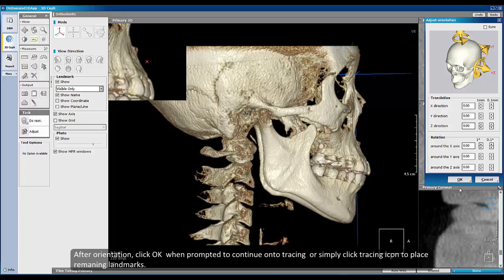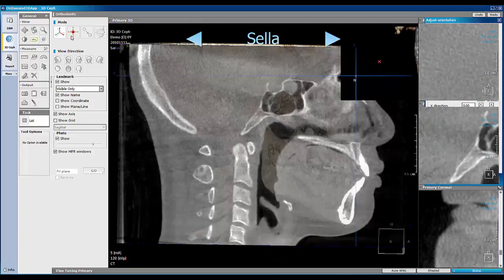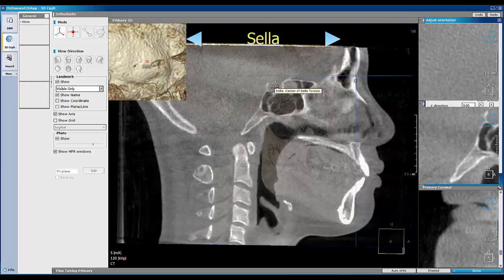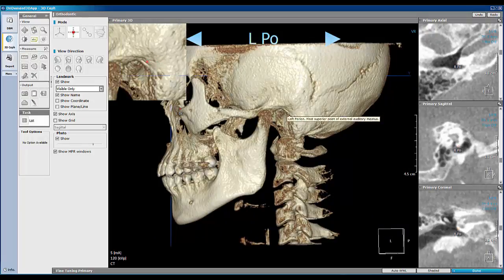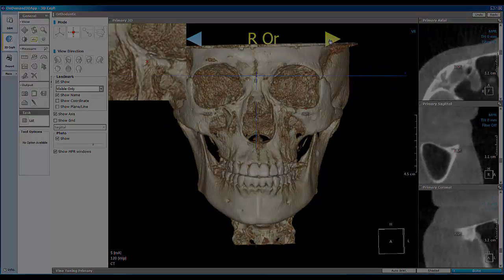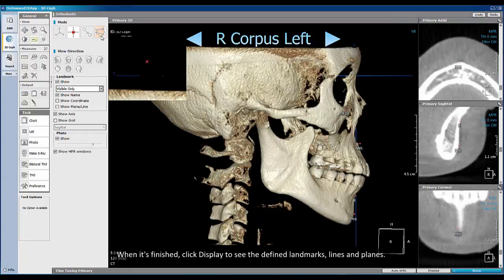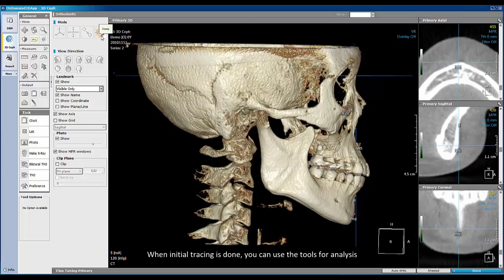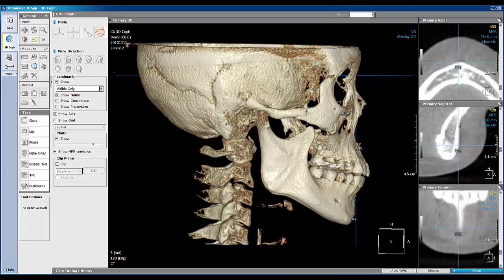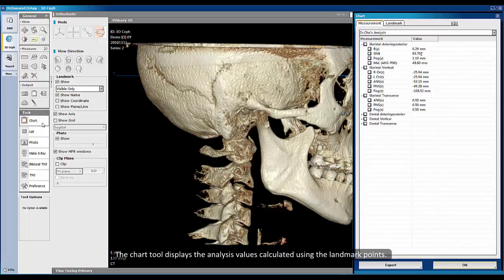After orientation, click OK when prompted to continue onto tracing, or simply click the tracing icon to place remaining landmarks. When it is finished, click Display to see the defined landmarks, lines, and planes. When initial tracing is done, you can use the tools for analysis. The chart tool displays the analysis values calculated using the landmark points.